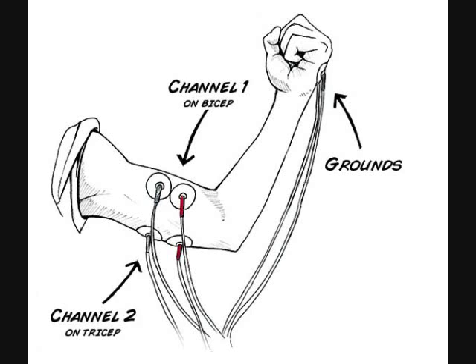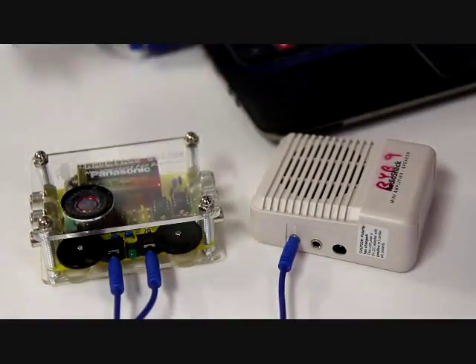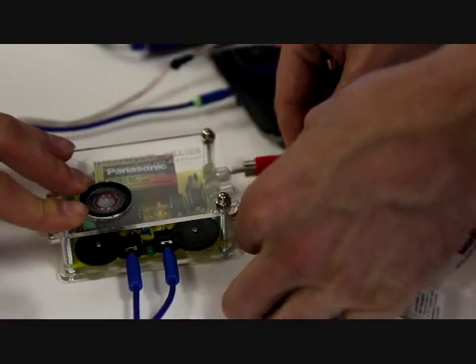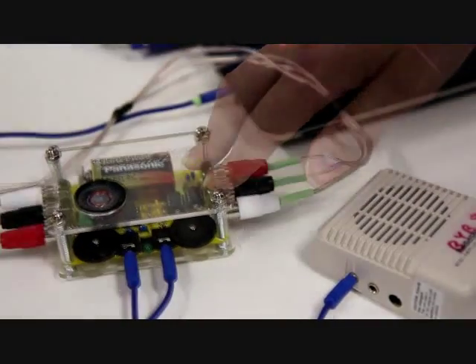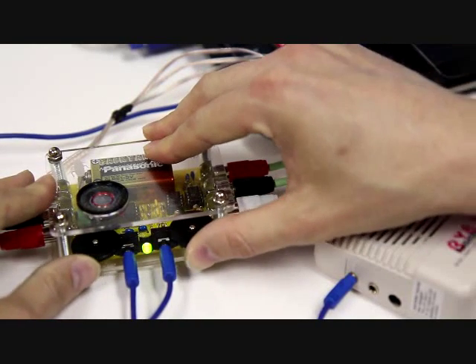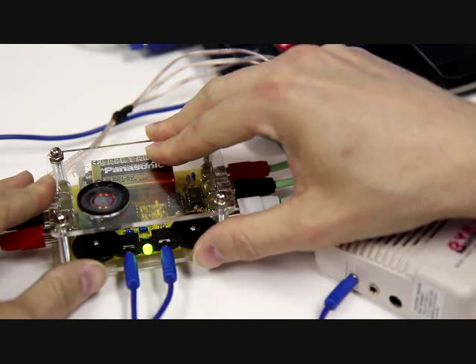Once you are all set up, it should look like this. Next, we will have to hook up our speaker and the computer so that we can hear and see our EMGs. Then plug in your electrode cables, making sure not to mix up your colors or channels. Then turn on your EMG Spiker Box and turn up the volume until you can hear activity from both channels.